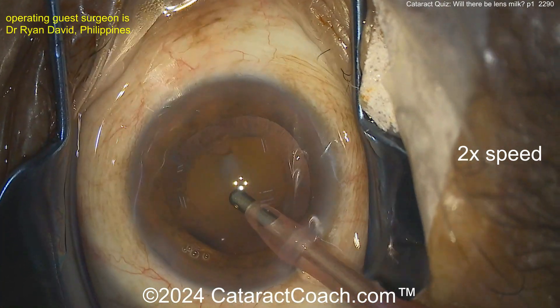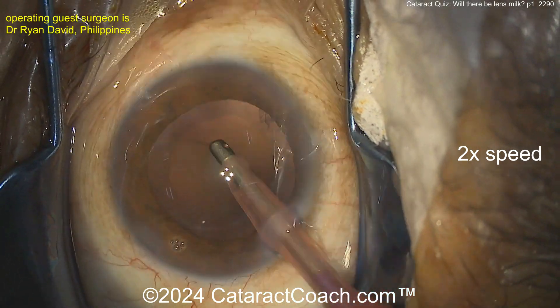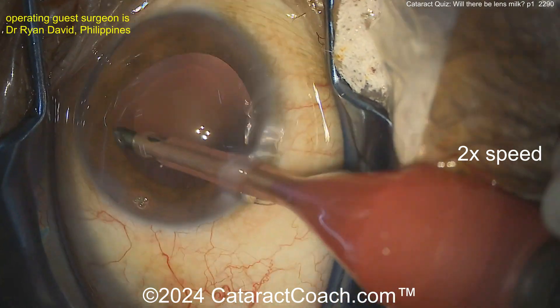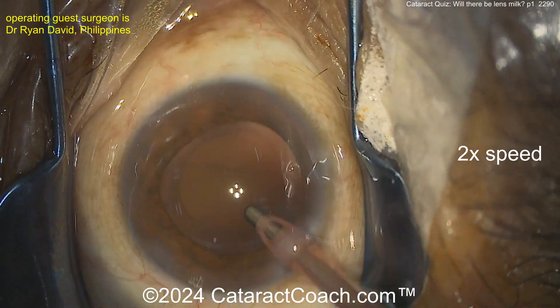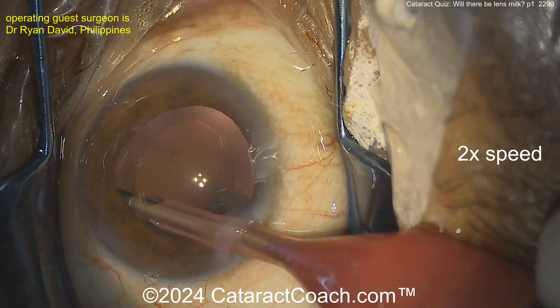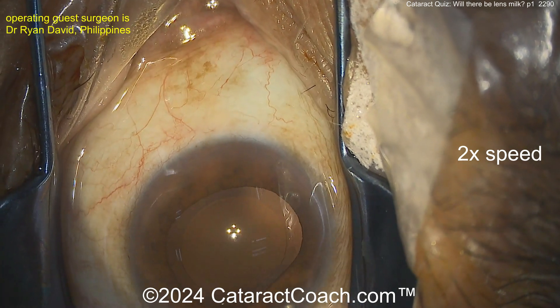Cataracts out - let's clean up the cortex. With this type of cataract, not a whole lot of cortex remaining. Clean this up as much as you can. If there is some scarring on that posterior capsule, what do you do? If it's a fibrotic posterior capsule, try to take it out if you want, but just get the lens in and you can always do a YAG laser another time. If there's a little bit of lens material that's fibrotic or stuck on the capsule bag, you just YAG it.